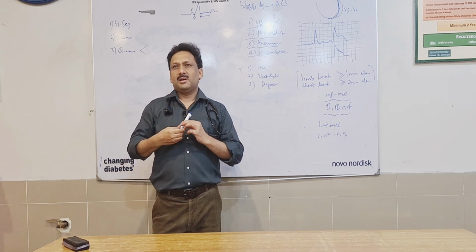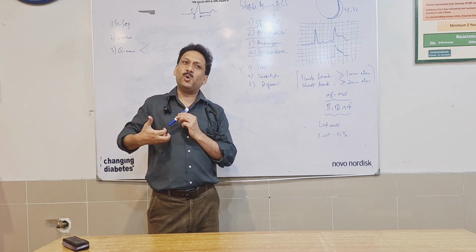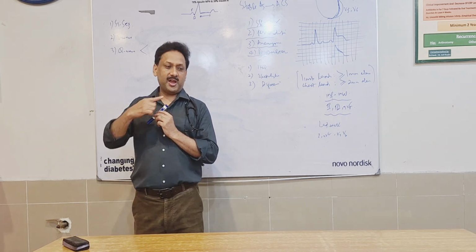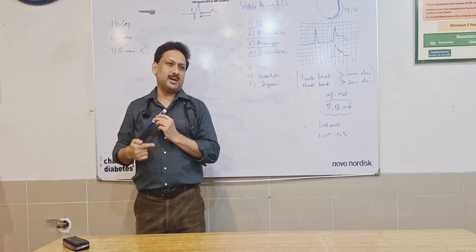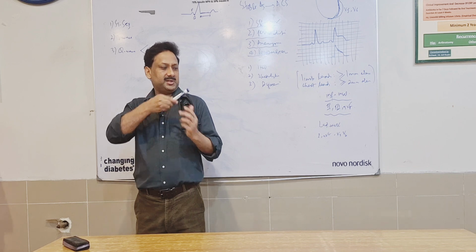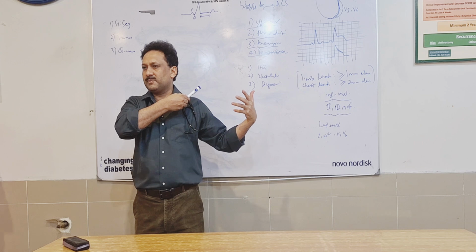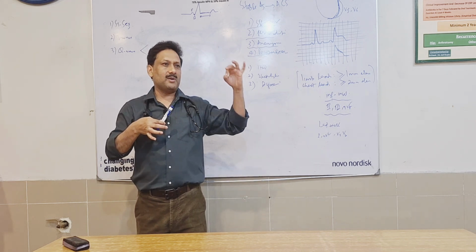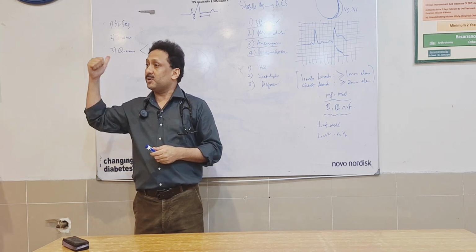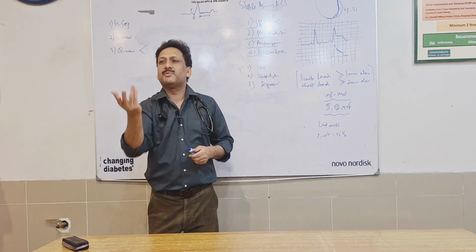In a certain person, a person is having right ventricular hypertrophy, the cardiac axis will be directed like that because axis is pulled in that direction where a wall is more hypertrophied. So now axis is like that, then which lead will show the T wave inversion or a Q wave? The lead which is at this angle, this is 1 and AVL. So 1 and AVL would be showing this kind of picture. So do not get confused. Always see the axis first. Axis changes the shape of all the 12 leads. But what we discussed in last session, I told you how these 12 lead waveforms are formed.